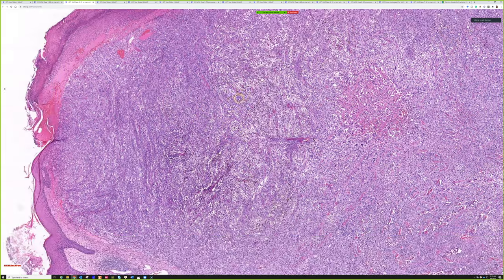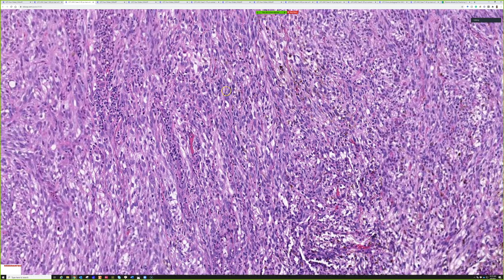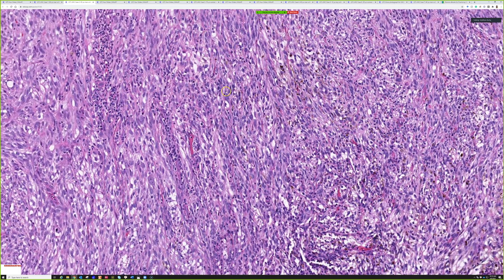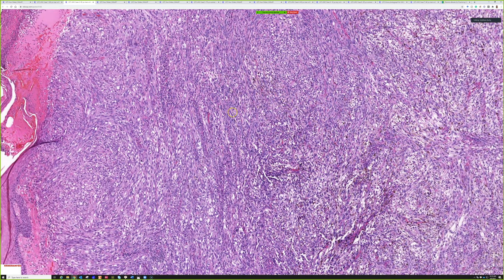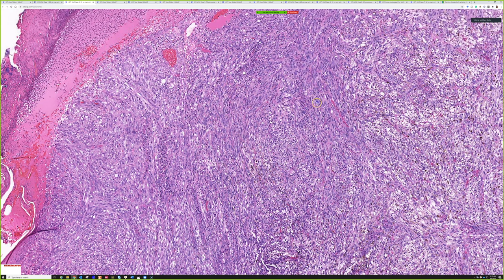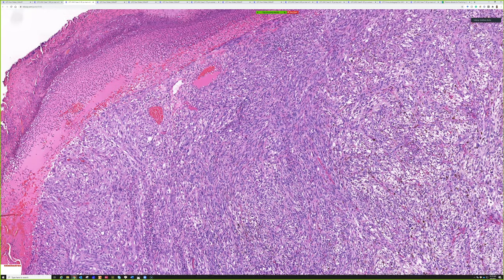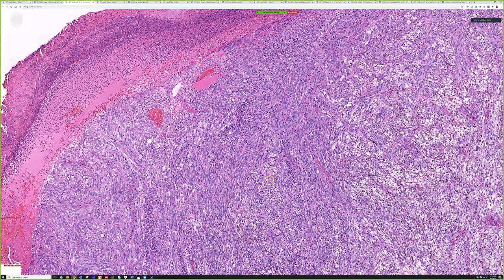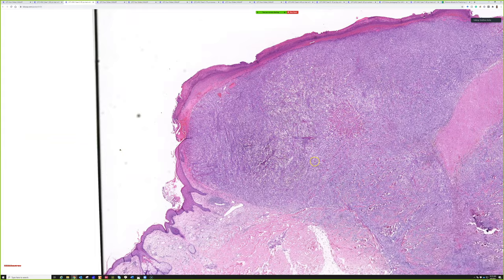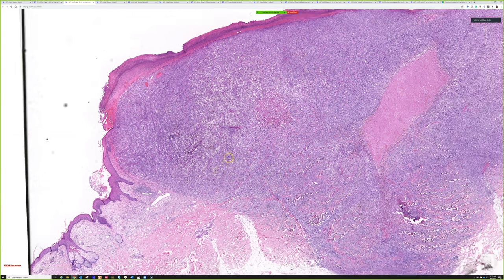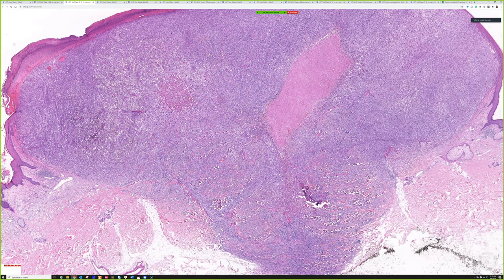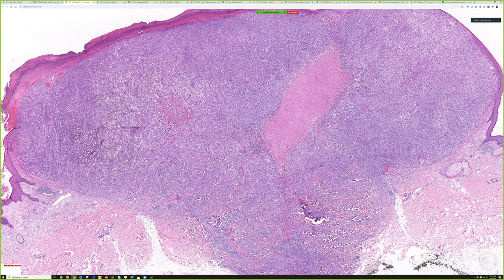Another consideration given the clinical history of a rapidly growing nodular lesion is atypical fibrosanthoma, or AFX.